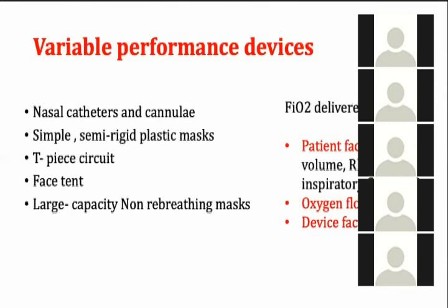The term variable means the fraction of oxygen that is delivered to the patient varies with several factors.